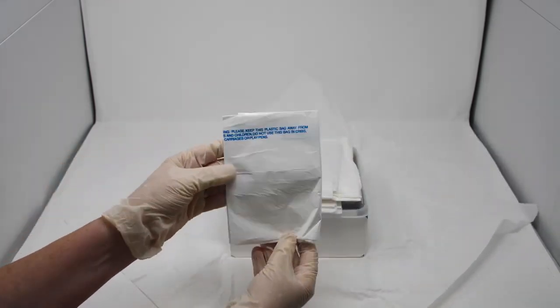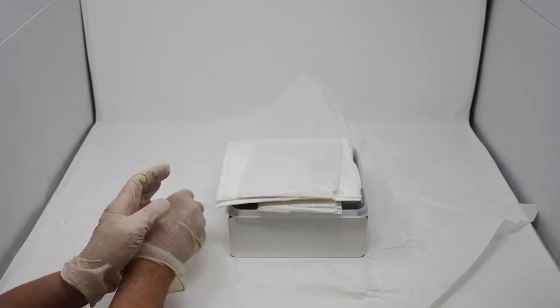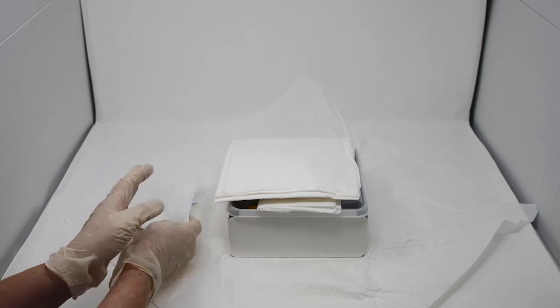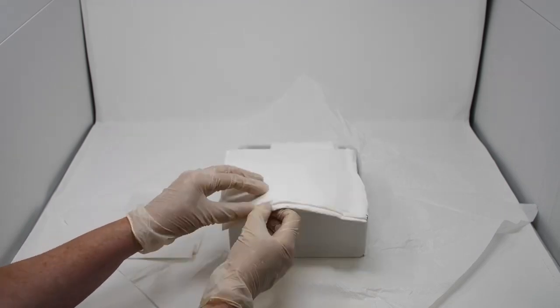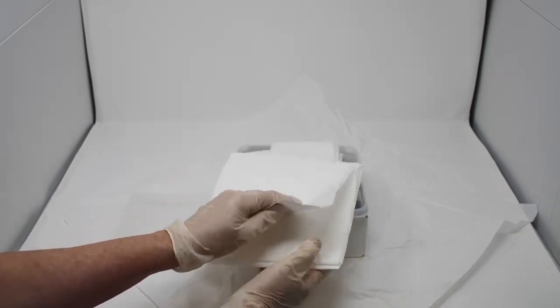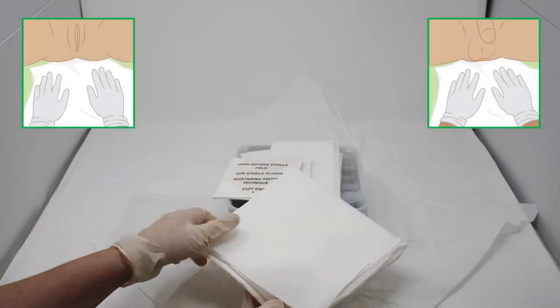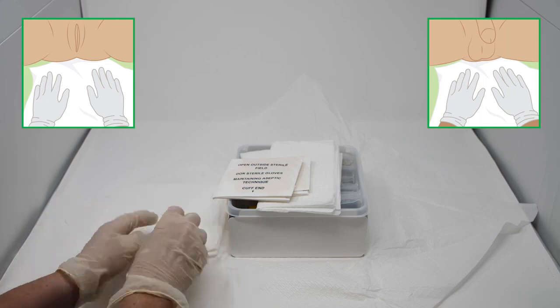The disposal bag is only available in the community tray. Next is the underpad. One side is waterproof — the shiny side. Place the underpad beneath the patient with the shiny side face down to protect the bedsheets.